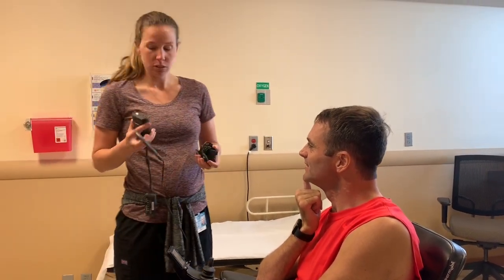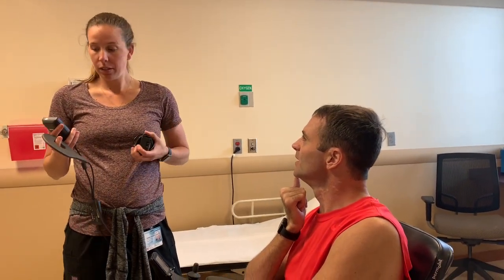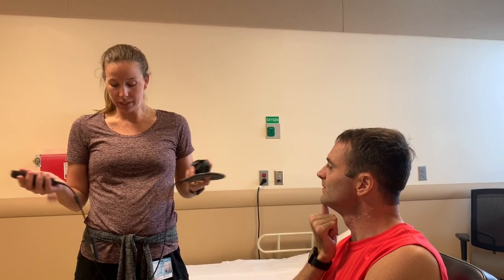And to charge this guy, you can just plug it in the wall. Cool. Okay. How long does that one take? I have no idea. But that one holds more than one complete charge for the internal battery. Yeah. Okay. And that's it, really.